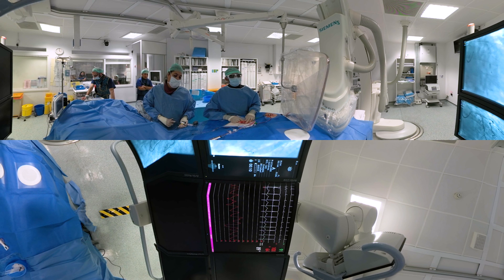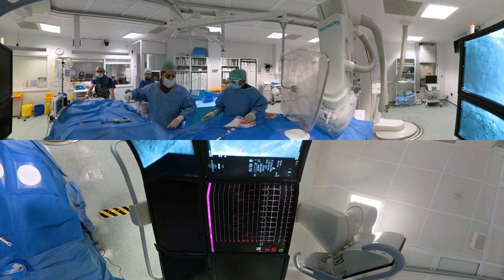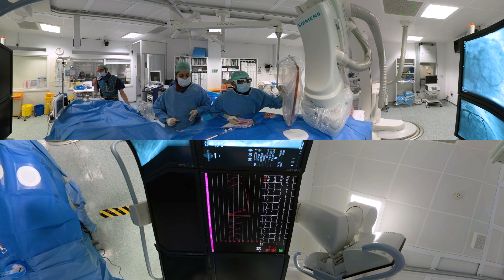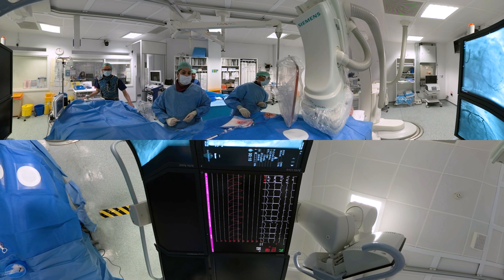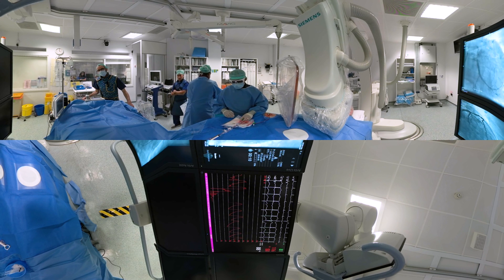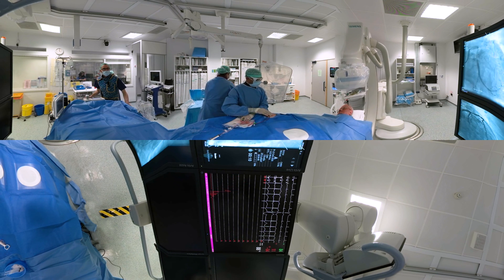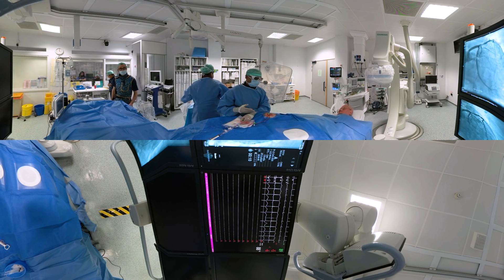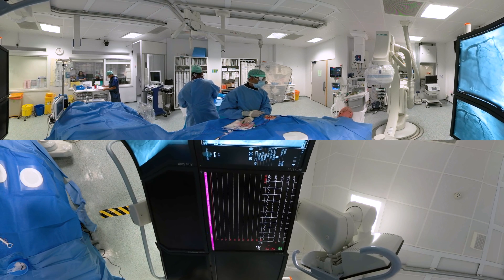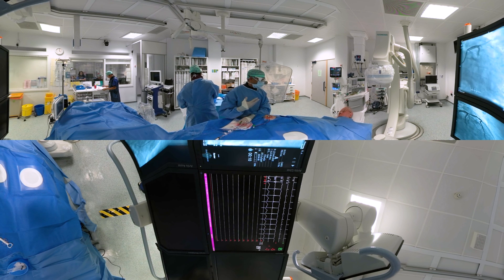The stent is now in the artery — it's opened the blockage and acts as a scaffold to keep the artery open. That's the procedure complete; we've treated the blocked artery. We're going to take the catheters out now. Taking this tube out of your wrist can leave some bruising. If you came in for this as a planned elective procedure, we might let you home the same day, but because you've come in as an emergency, we're going to keep you in overnight and just make sure everything settles down.